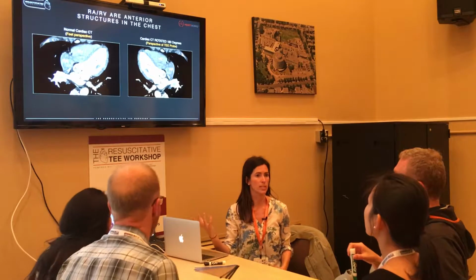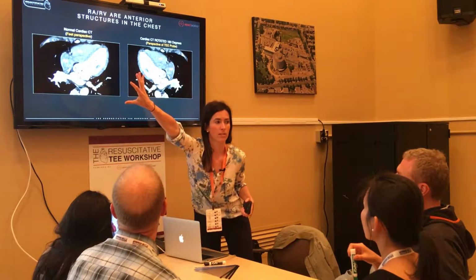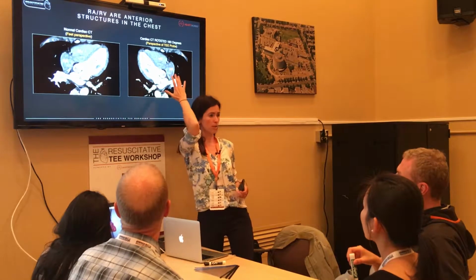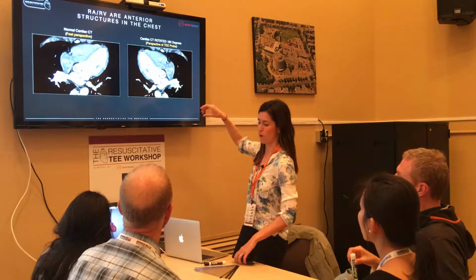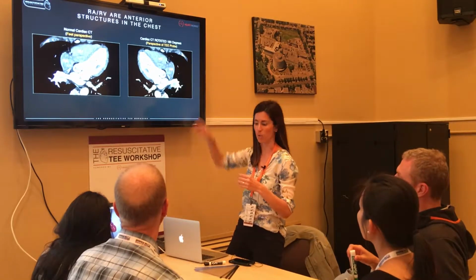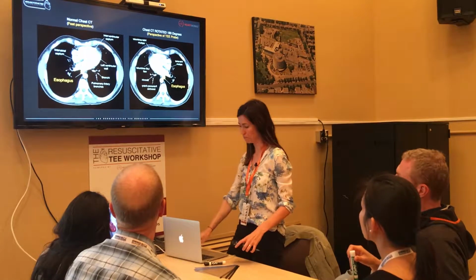Cool. So one of the ways that we have tried to conceptualize this is by looking at CT scans. So we read CT scans all the time, right? And we know that we read them. This is on the left side of the screen from the feet, right? And then the head is extending through the screen, okay? So if I take this image and I flip it 180 degrees, I'm now reading this CT scan from the patient's head perspective with the feet shooting through that screen, okay? And this is how we want to think about TEE, coming down from the head through the esophagus, okay?